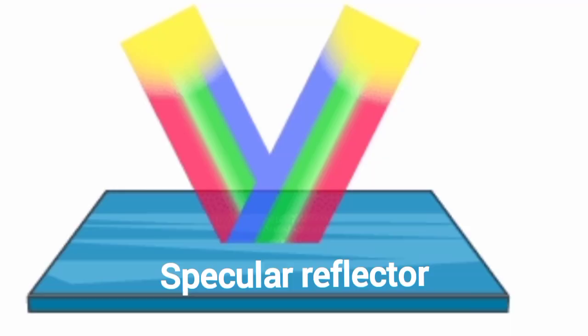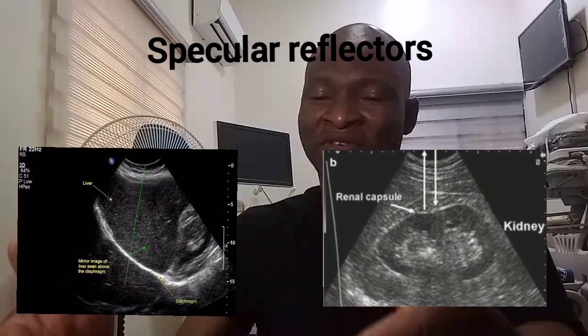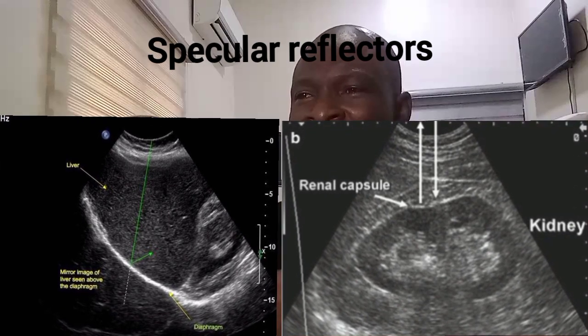Specular reflections occur when the reflecting surface is large in comparison to the wavelength of the incident sound beam. Specular reflections occur at organ boundaries and at the surface of large blood vessels. Examples of large surfaces are the diaphragm, capsule of the kidney, wall of the aorta, wall of the common bile duct, pericardium of the heart, and so on. So specular reflection is very angle dependent but essentially frequency independent. The actual amount of sound energy reflected at the specular interface is dependent on the acoustic impedance mismatch.